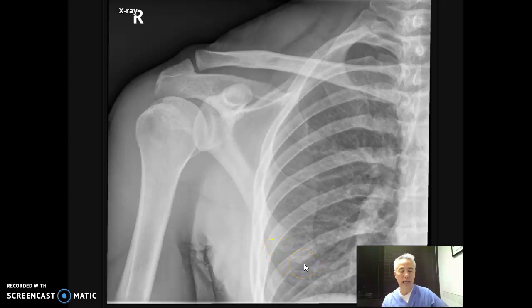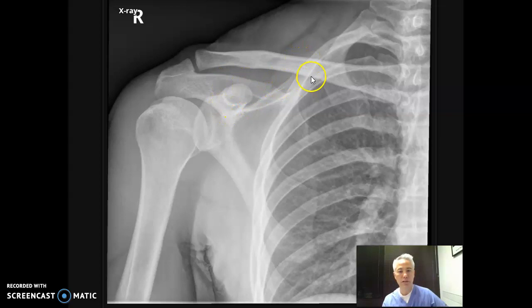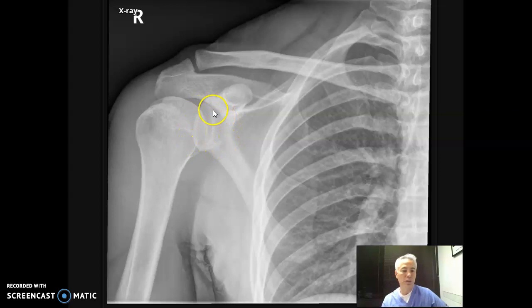What you should notice is that you will see the entire length of the clavicle going across. You'll see the acromial portion of the scapula, this little portion here is going to be the coracoid, and the superior angle. This would be your medial border, your lateral border, and your superior borders extending from the superior angle to the coracoid process. Here you have your glenoid cavity and the neck going across. Those are your parts of the scapula. The head of the humerus should be all the way on there, and you're going to get probably about a third to a quarter of the body of the humerus as well.